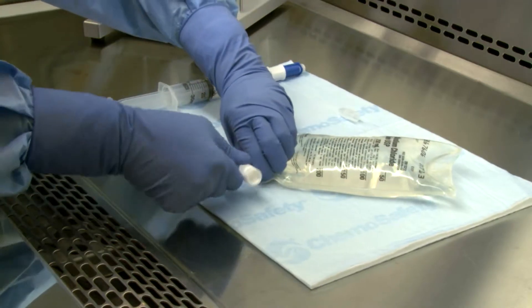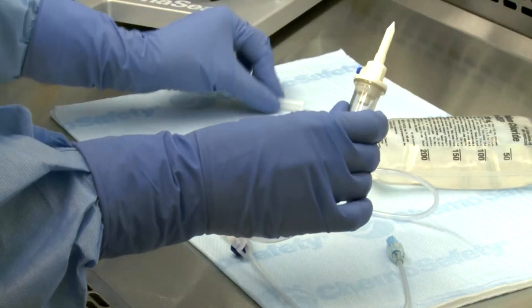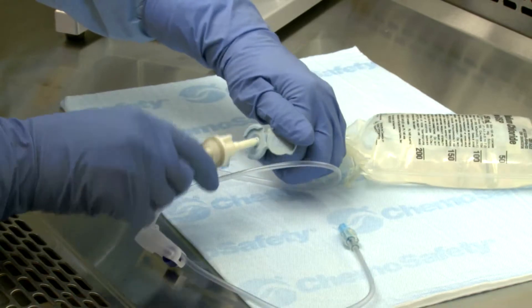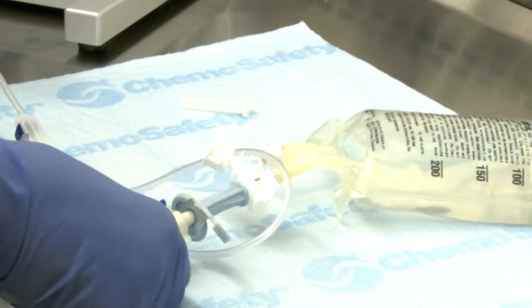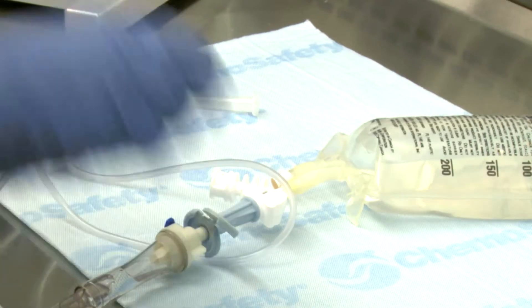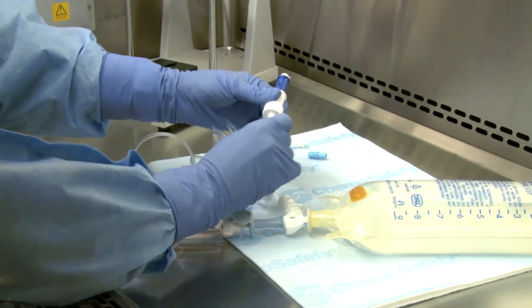Ensure the spike of the infusion adapter is fully inserted by confirming the port of the IV bag is up and over the shoulder of the infusion adapter. If the IV line is being primed in the preparation area, open the blue cap on the distal end of the infusion adapter and spike the administration set into the infusion adapter. Prime the line according to the manufacturer's instructions or your facility's policies and procedures. If required by facility protocol, luer lock an injector to the end of the IV administration set.